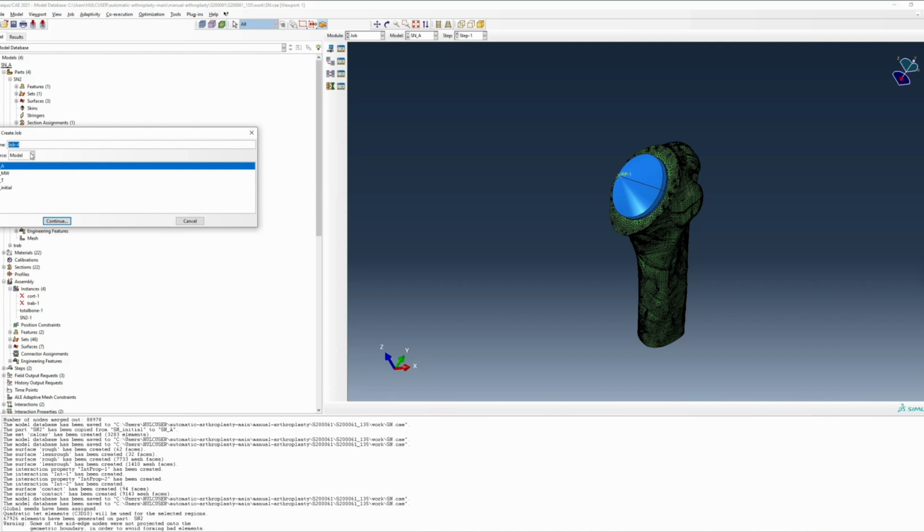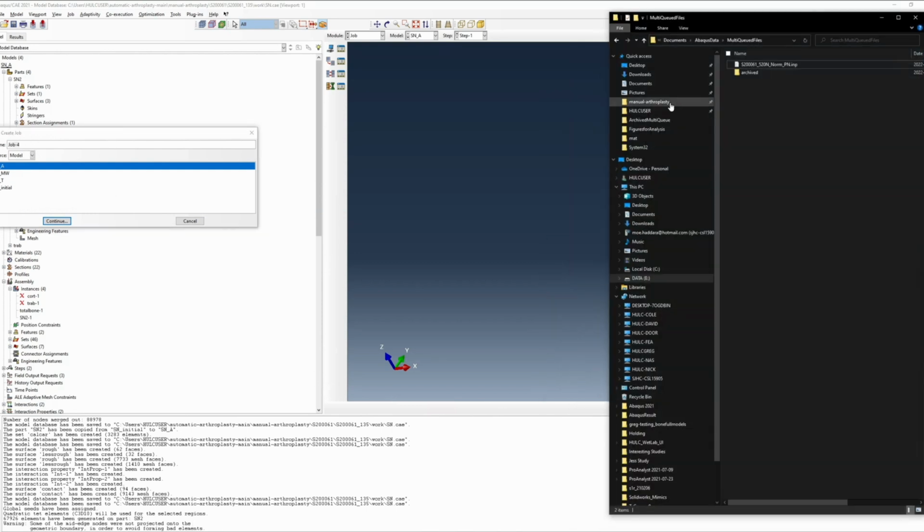We should now be ready to run analysis. Create a new job to perform a data check to ensure that your models are acceptable.